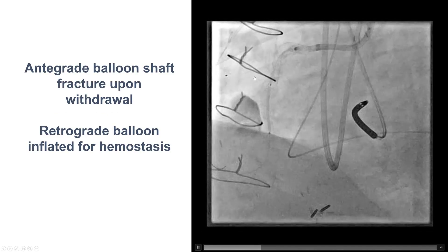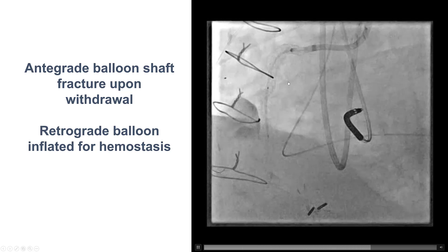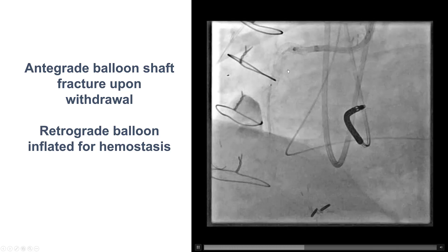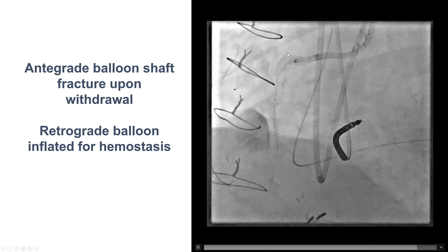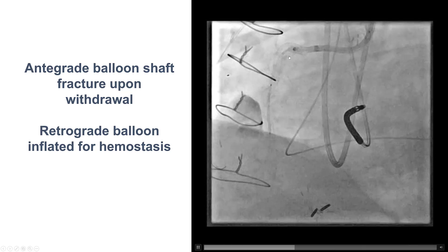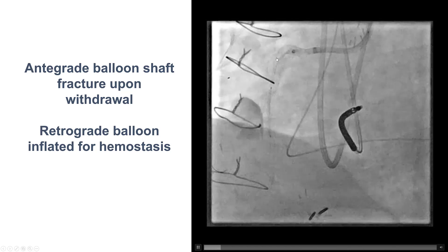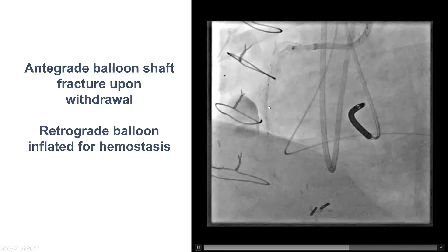So we inflated, we deployed the stent, and then we inflated the antegrade balloon. But then, as we were trying to withdraw the balloon, we withdrew it a little too early, so we had fracture of portion of the balloon that remained within the proximal right coronary artery, while we still had not achieved hemostasis of the site of the perforation.